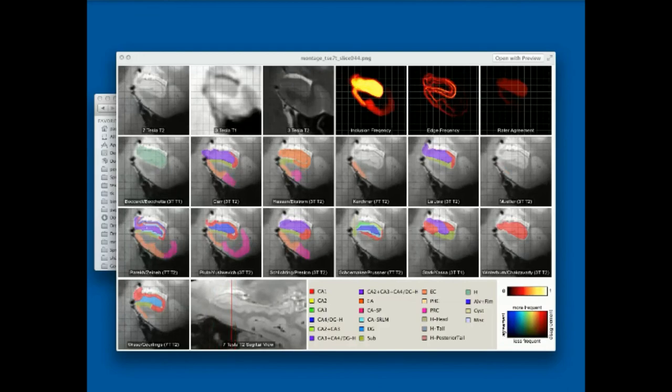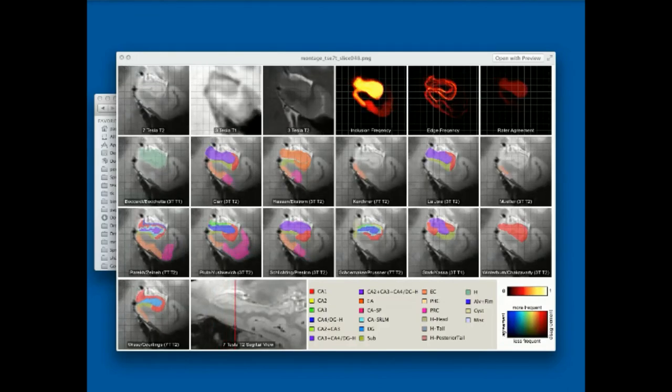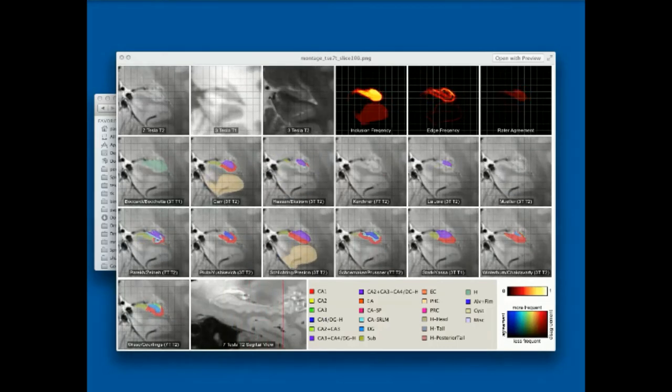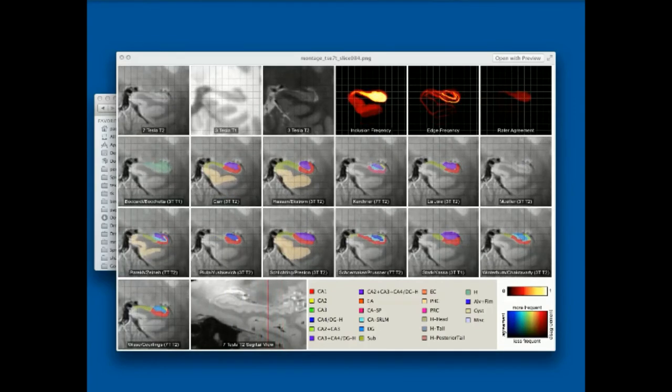The utility that Sandy mentioned for putting together these 2D PNGs into a nice figure is called ImageMagick. It has nothing to do with our group, but it's a free utility that's very complementary to this. All these overlap measures and different group-wise comparisons between these different segmentations and all of these slicing commands are in a script that runs C3D in a few commands. So when somebody submits a different segmentation or a new person joins this group, I can just rerun my script and I have these figures done in about 10 minutes. So it really can be powerful.